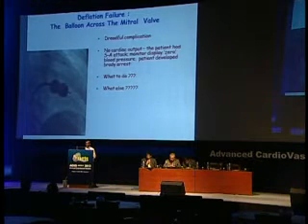And coming finally to one of the most dreaded complications, the failure to deflate. One personal experience: we had inflated the balloon right across the mitral valve, and tried to deflate, and we couldn't deflate, and then the patient had an attack and zero blood pressure, and then the patient developed bradycardia and arrest. And what to do? There is hardly any algorithm, and you can do very little.